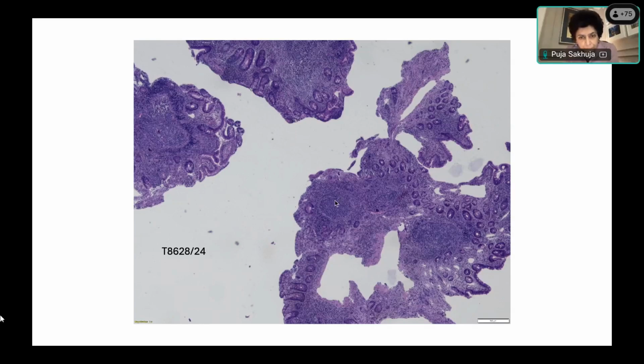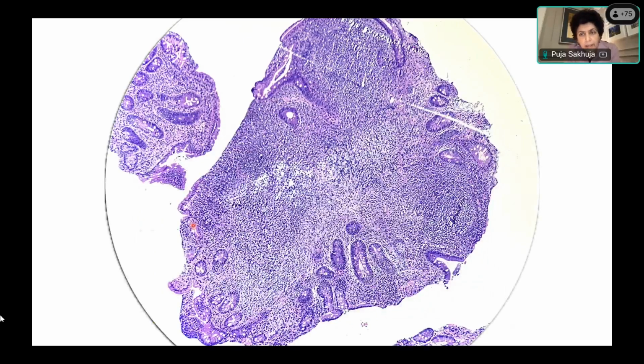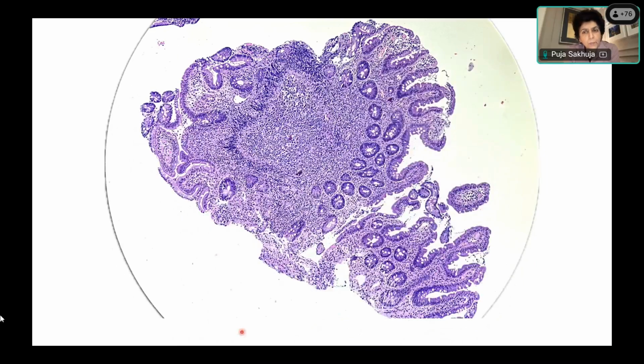Okay. Very good. So now, as we go down, we see this again, the lymphoid follicles, which you have very nicely described, correct? And then the blunted villi, but these are all artifactually blunted. Okay, ma'am. And then, is there anything else you are seeing in this? If you managed to see the absence of plasma cells, then you have increased the magnification, and that means there's something else here that you should have seen. Is there anything else?